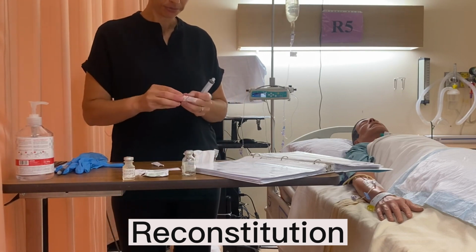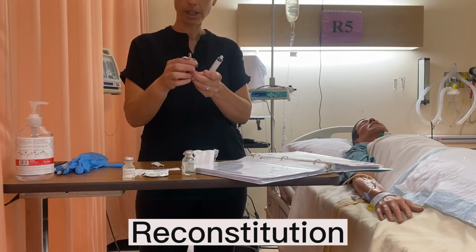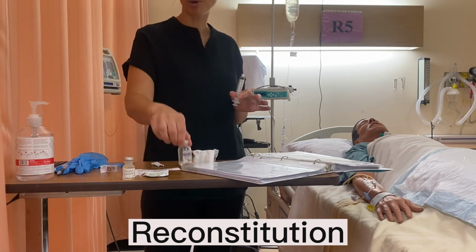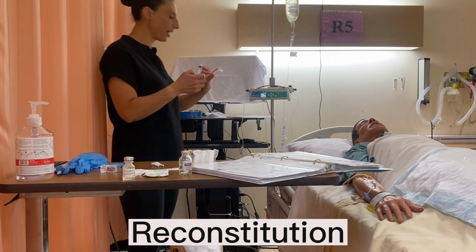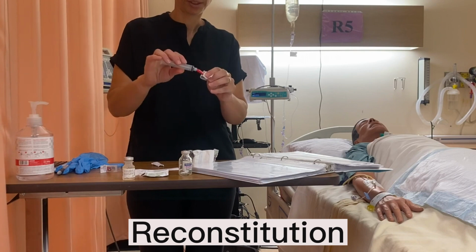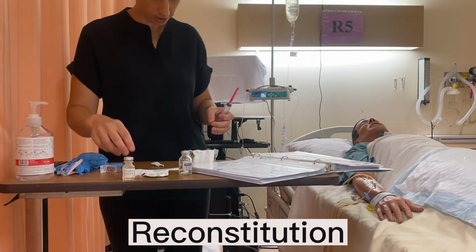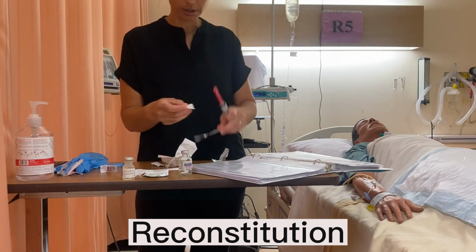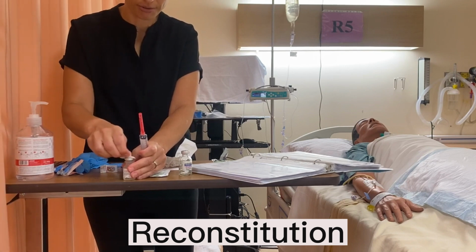Okay. And then we have our, this is a filtered blunt fill needle. I don't need a filtered blunt fill needle because there's no glass particles. It's not an ampule. So I'm actually going to go to my supply and find my blunt fill regular needle. I'm going to attach that. Okay. Oh, and the other thing I'll need to do too is swab the other top. So I'm going to grab another alcohol swab. Swab the top there. 30 seconds, dry for 15.